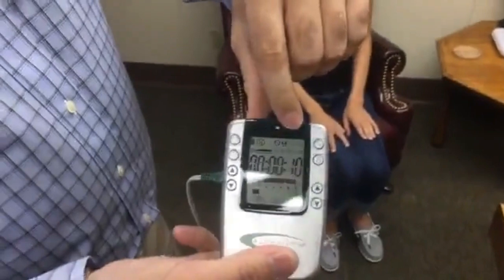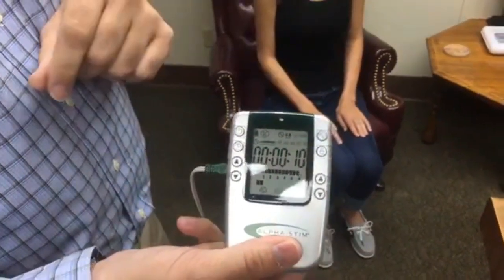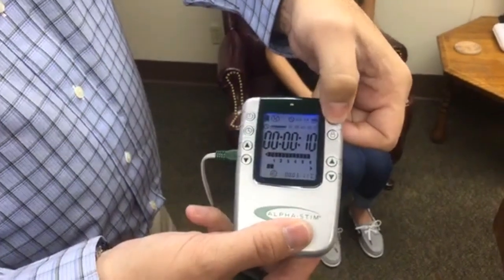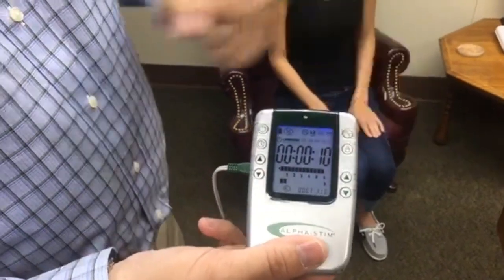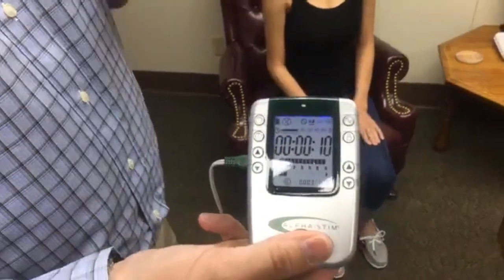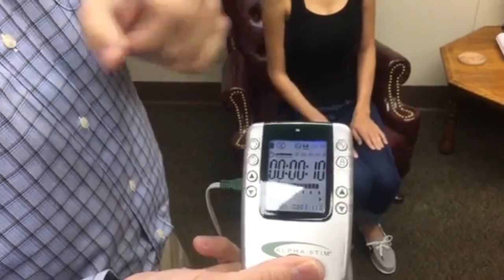First is the frequency, and that's the most important setting. You'll see we have 0.5 Hz chosen. You can actually change that to 1.5 and up to 100 Hz. But 99% of the time you'll be on 0.5 Hz — that's where you want to start when we use the probes or when we use CES. So 0.5 is where you'll be set up.